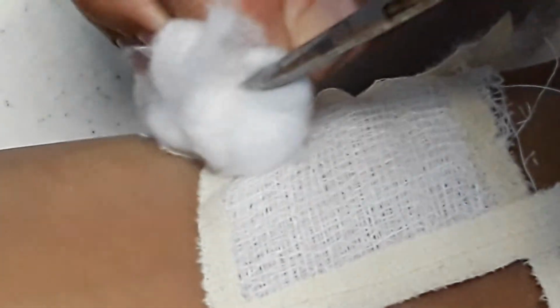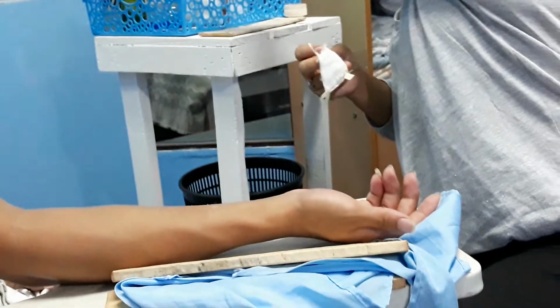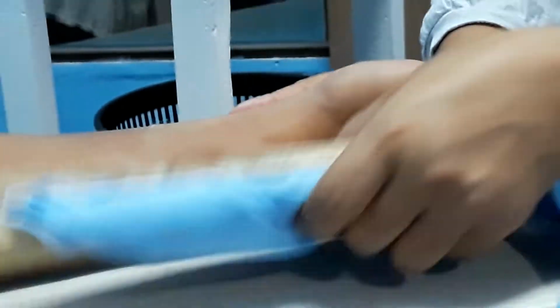You may apply now your new dressing, but again, in doing so, you have to wear your gloves. Like that. And then after that, you're going to discard, and of course you're going to contain the microorganisms by folding the soiled bandage like this, and then apply your other dressing. So that ends our demonstration on the application of your dressing. Okay, thank you.